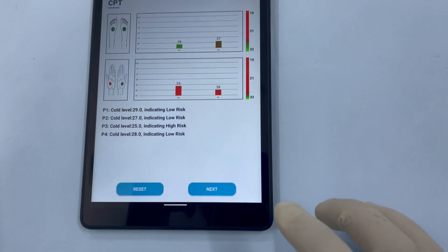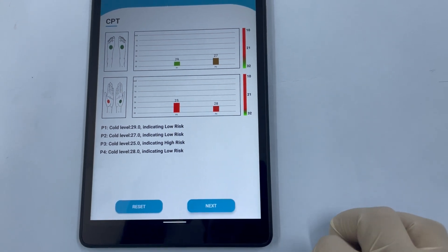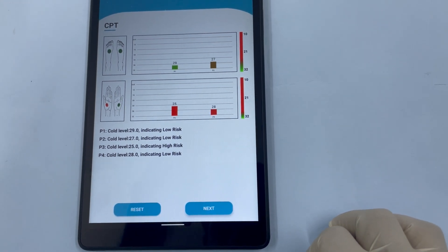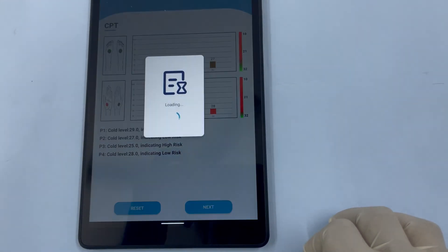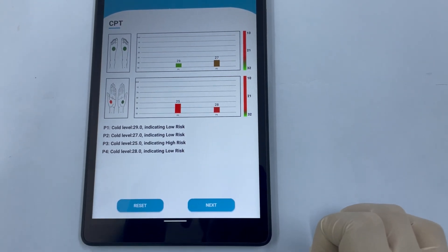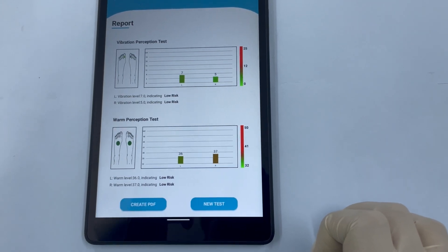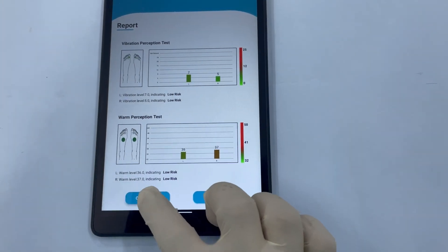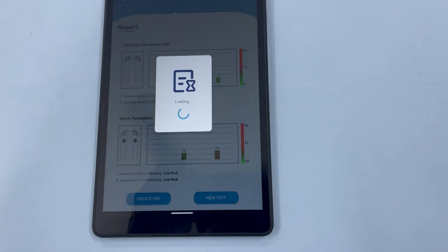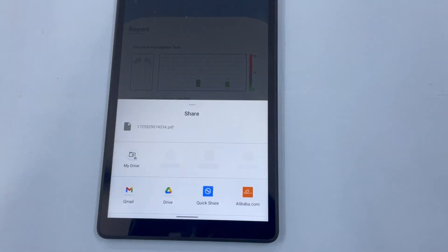Click the Next button at the bottom of the screen to access the final summary report in the app. To generate the final report in PDF format, click Create PDF at the bottom of the screen.